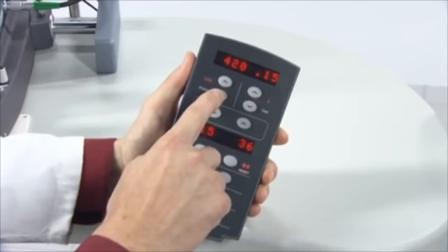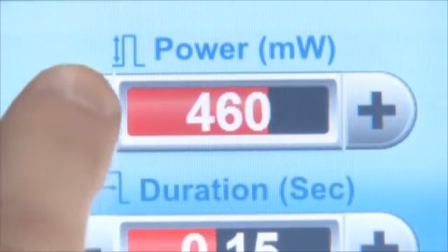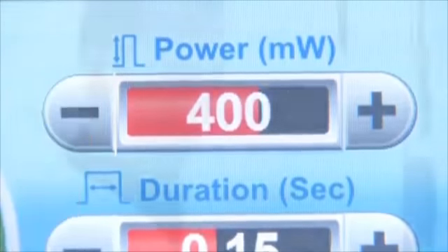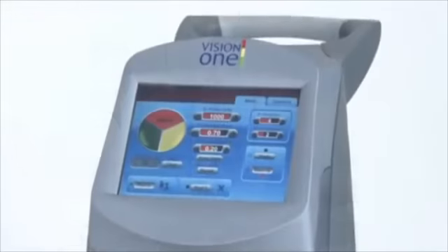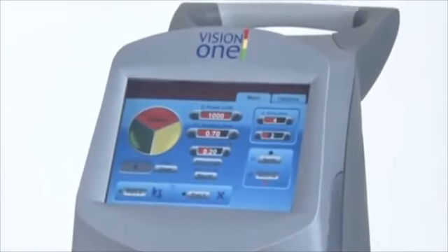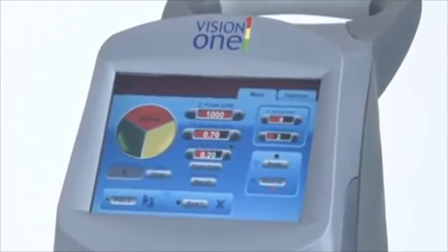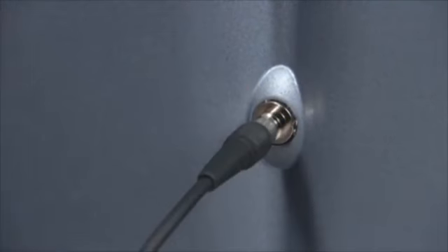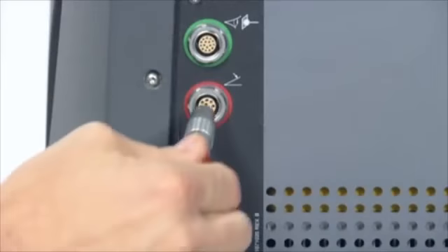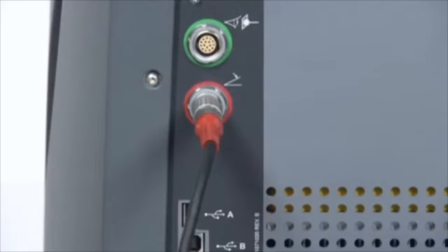Incorrect treatment settings can cause serious tissue damage. Therefore, it is recommended that you use the lowest acceptable treatment settings until you are familiar with the instrument's capabilities. Use extreme caution until you thoroughly understand the biological interaction between the laser energy and the tissue. Do not attach any objects to the control screen during laser operation. Doing so may result in erratic operation.